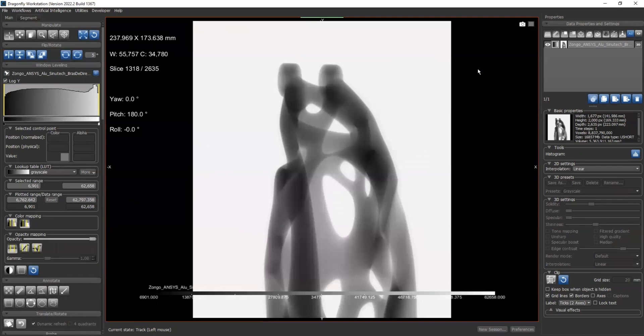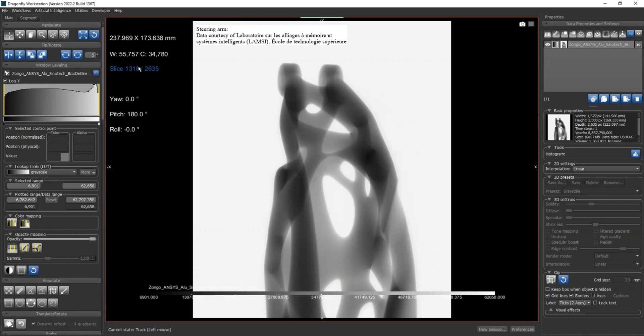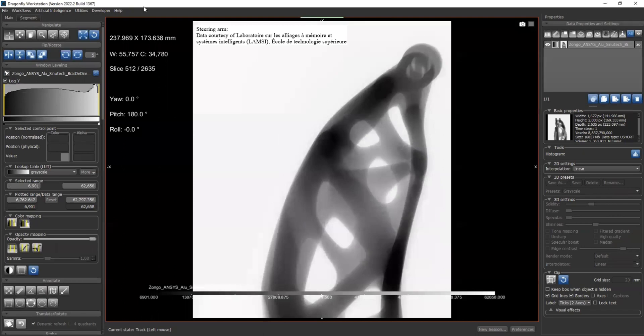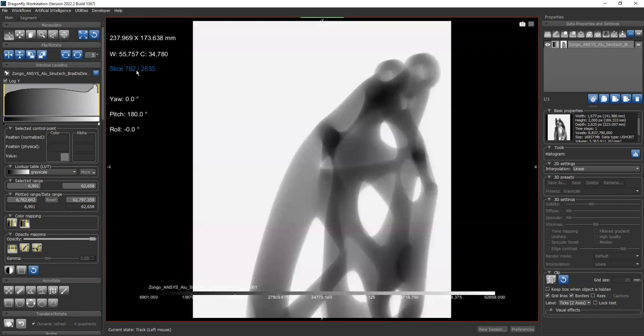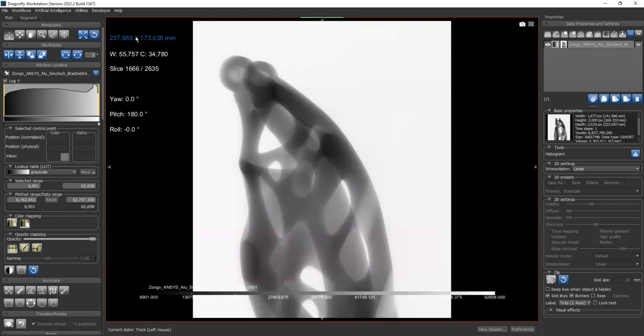All right, we have our dataset loaded. Go to x-ray plan. This is a steering arm dataset acquired on a Nikon Micron CT imaging system. I would like to thank Morgan Lettener for sharing this data with us. As you can see, we have this image detector plan on the x-ray plan, and the rotation axis is along the y-axis. So this is our requirement.